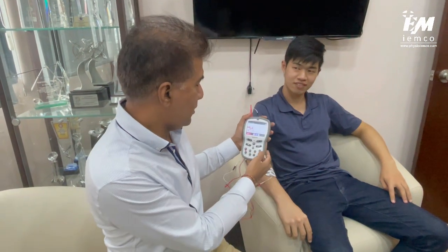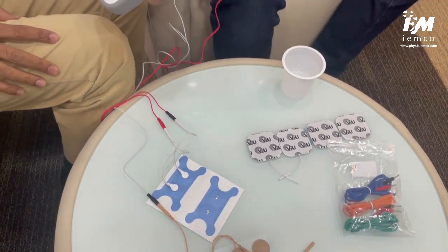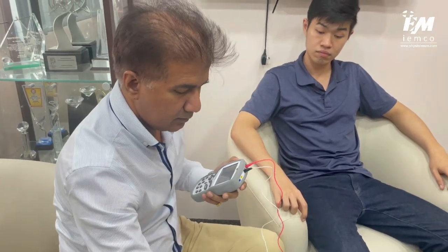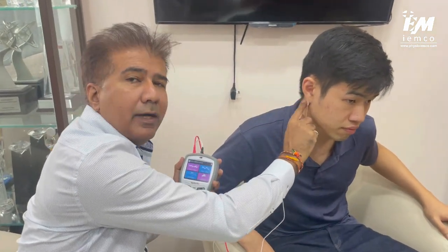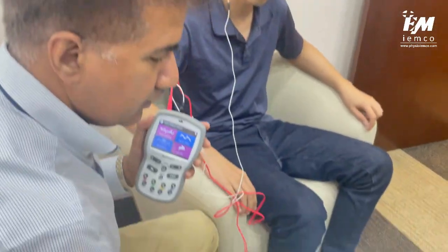Now I'm going to show you how to set up for swallowing muscle strength training of the laryngeal muscles. This is again your reference electrode, and these are your lead electrodes. I prefer to put the reference electrode on a bony area or non-contracting surface. Let's place the reference electrode on JJ first — I put it here because this area will not be contracting.